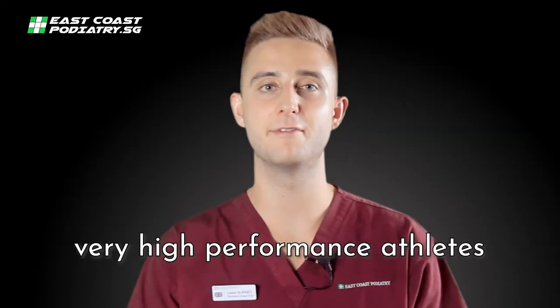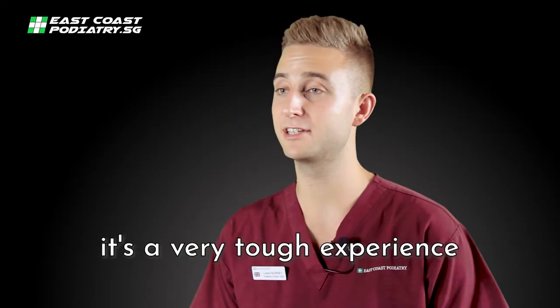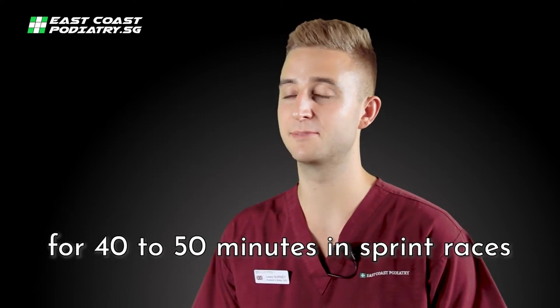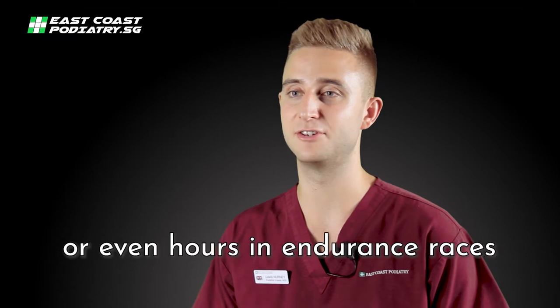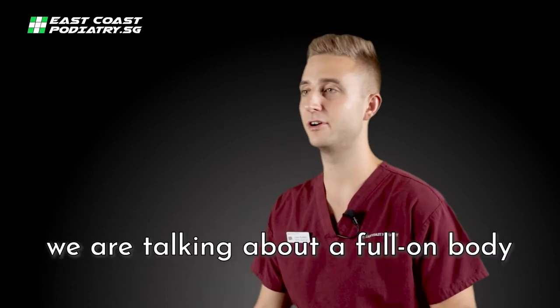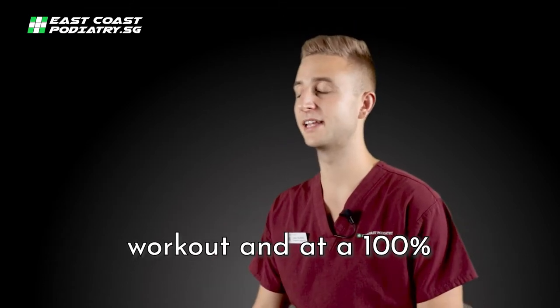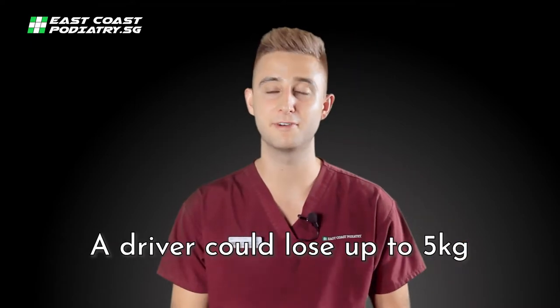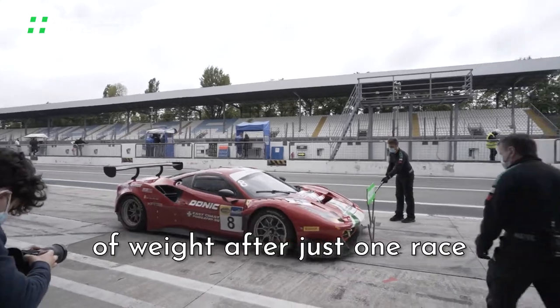Elite motorsport racers are very high-performance athletes. It's a very tough experience in the car with no air conditioning for 40 to 50 minutes in sprint races or even hours in endurance races. We are talking about a full-on body workout and 100% mental concentration at every second of the race. The driver could lose up to 5kg of weight just after one race.